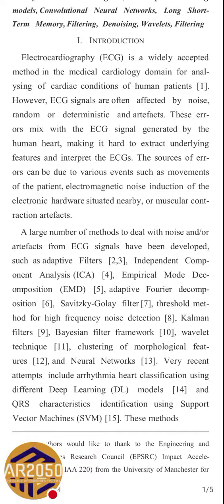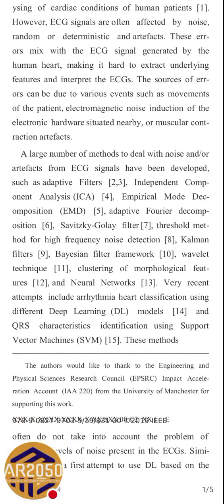Although the medical grade machines are very well filtered for that kind of noise, still there could be some electromagnetic noise. So this is a very complicated noise.